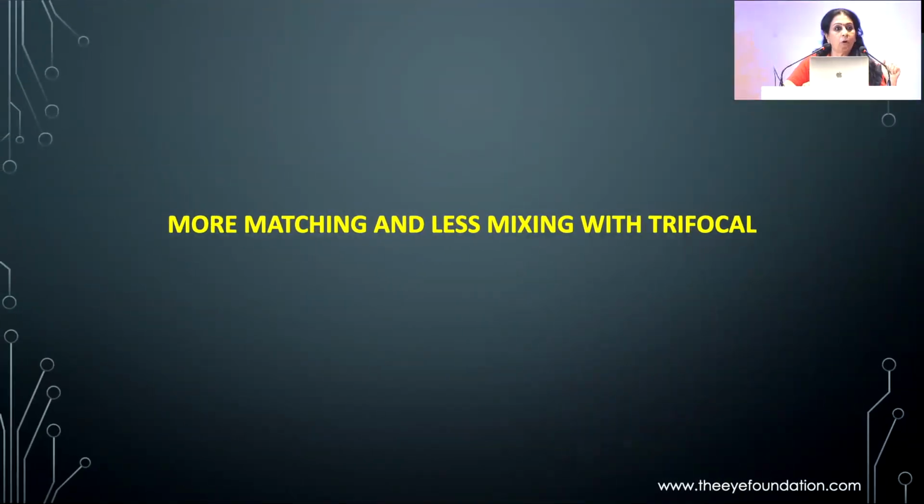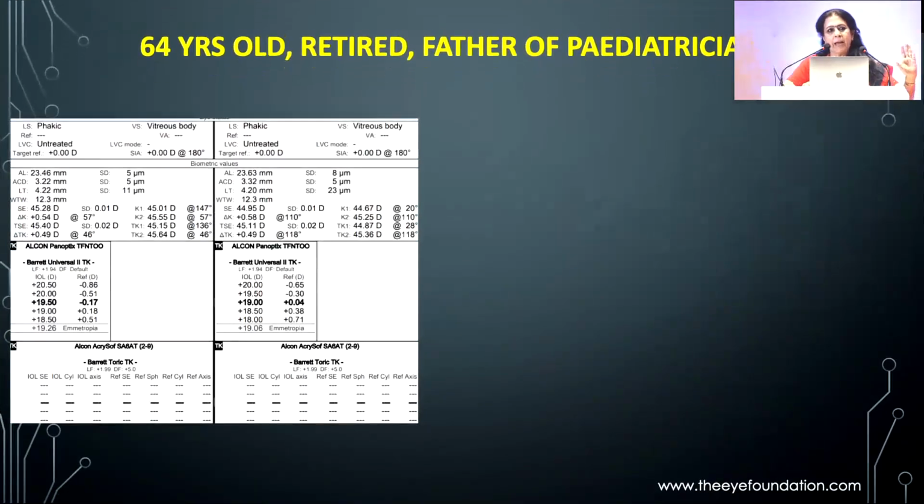This is fairly straightforward. Here, if one eye was seeing a little less one year, you could match it with a little micro monovision in the other eye and still keep him happy without mixing or giving another design of lenses.